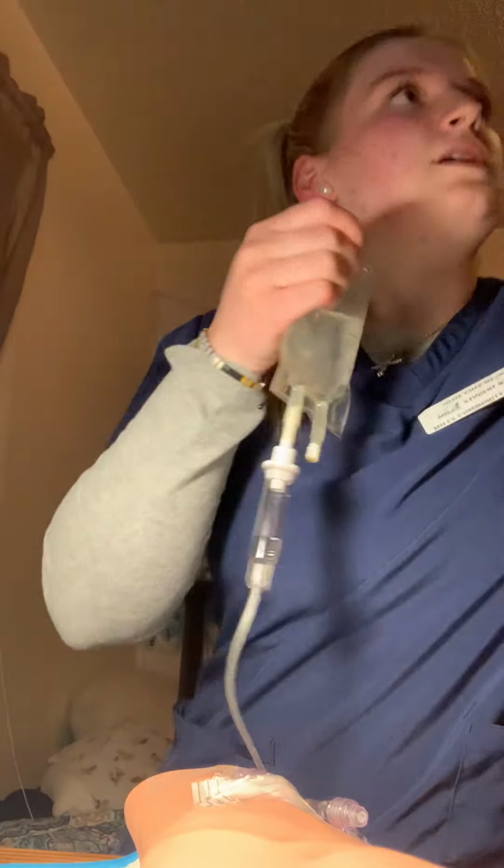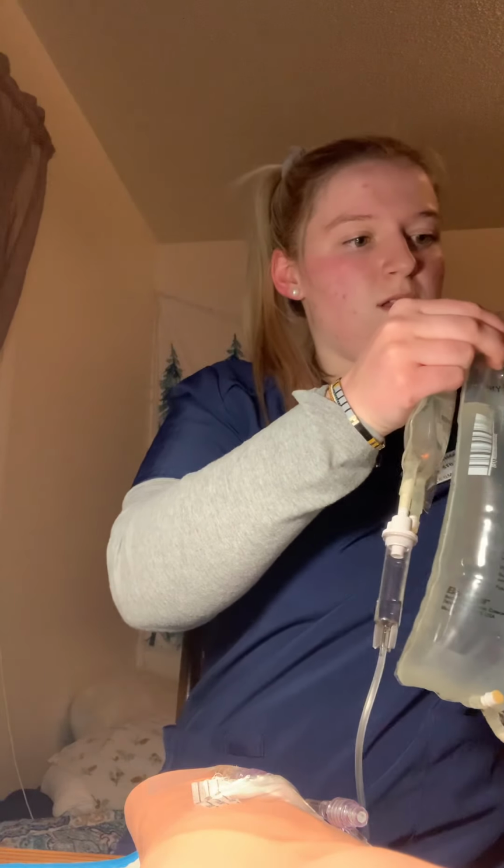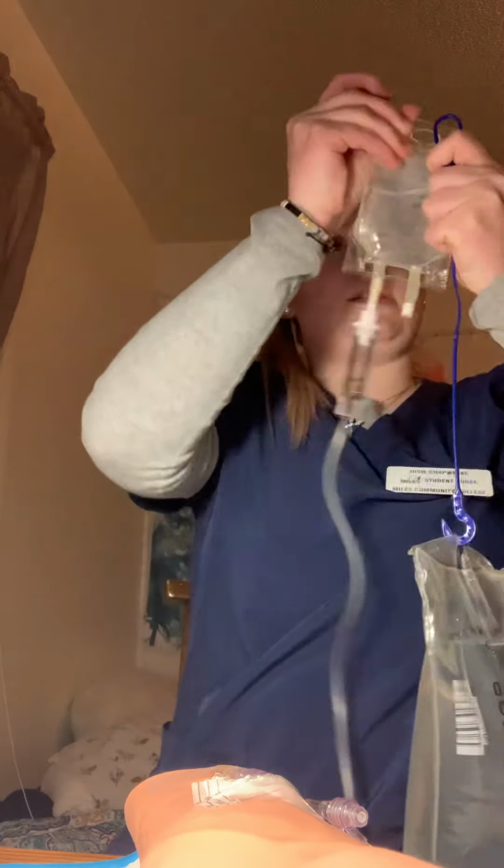So for an IV piggyback, you're going to want to hang the secondary bag above the primary bag. So you'll want to take this bag down, and then you'll add it like this to your IV pole here. And then you'll clean off that, uncap the piggyback, and hook that. All right.